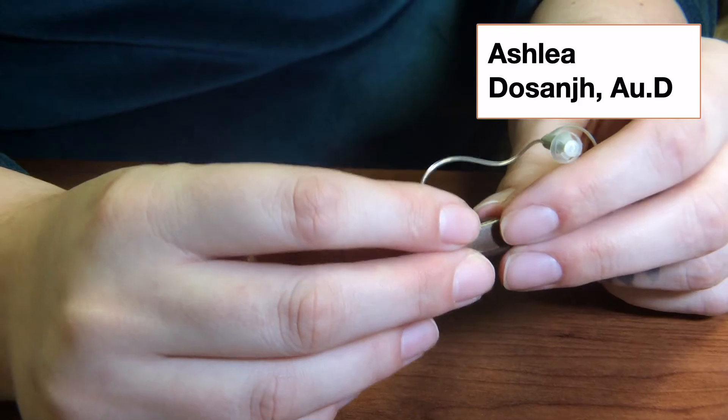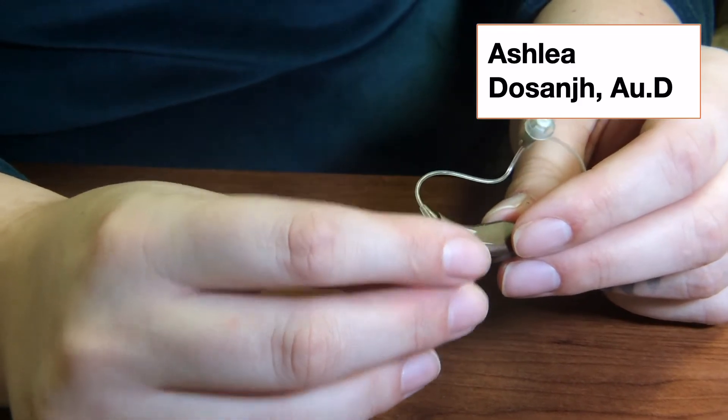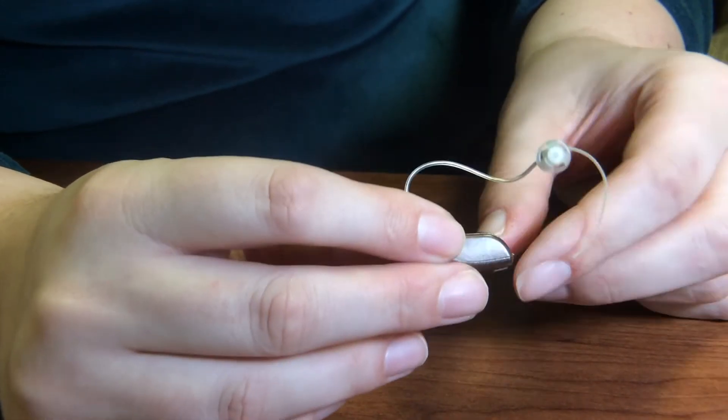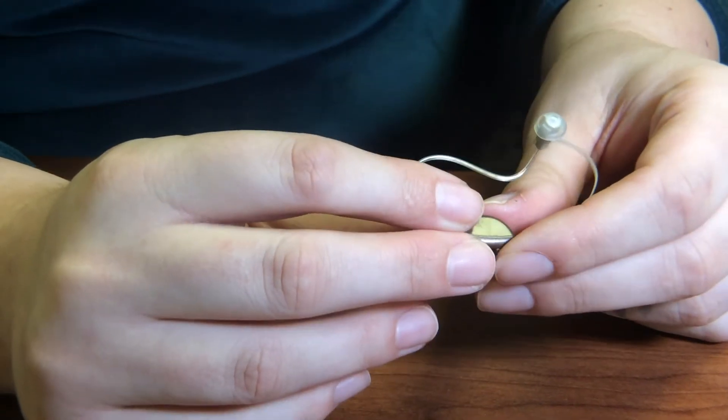This is Ashlea Dosanjh. I'm an audiologist and we are looking at a RIC hearing aid with a battery door. RIC stands for receiver in the canal.